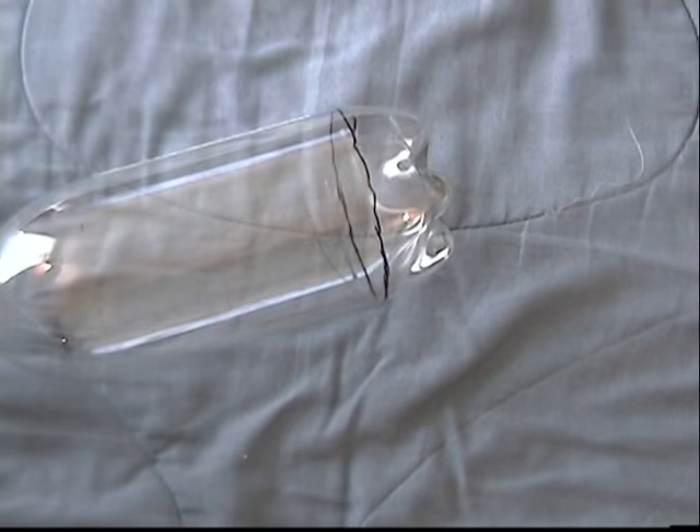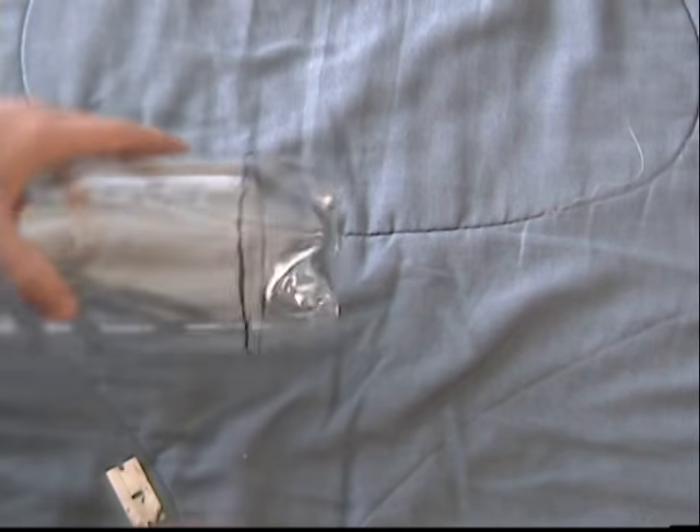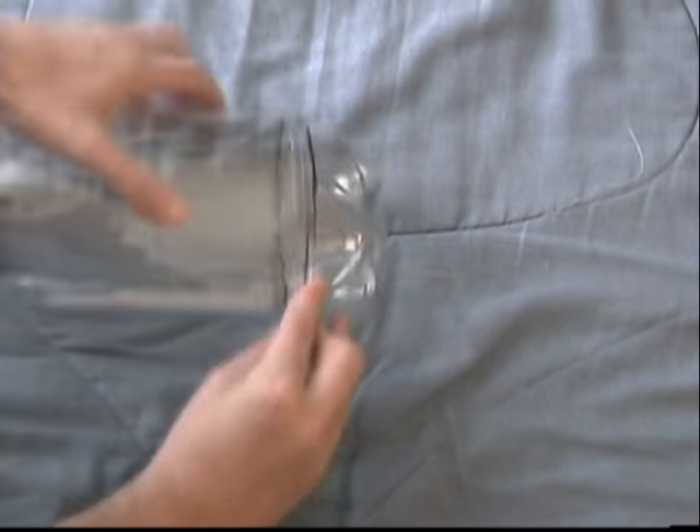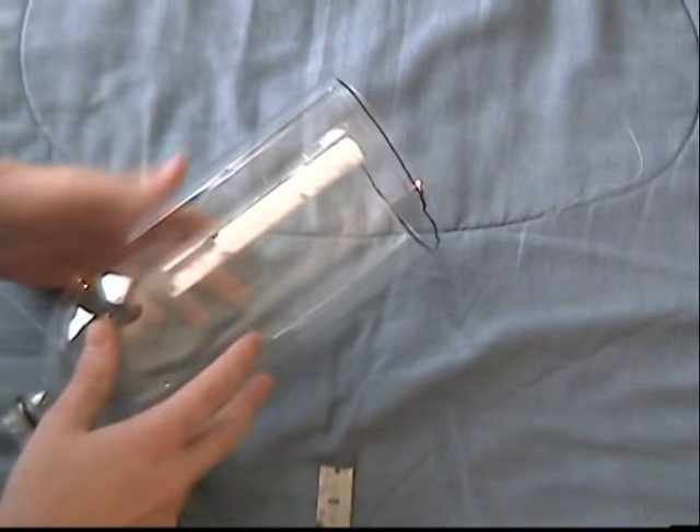Now on to the 2 liter plastic bottle. This will serve as a medical mask and protective eyewear. We begin by marking and cutting the bottom of the bottle. Be careful whenever you are using a cutting tool. Save the bottom for later as a bowl.